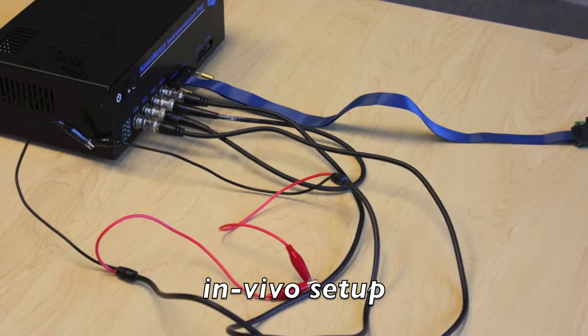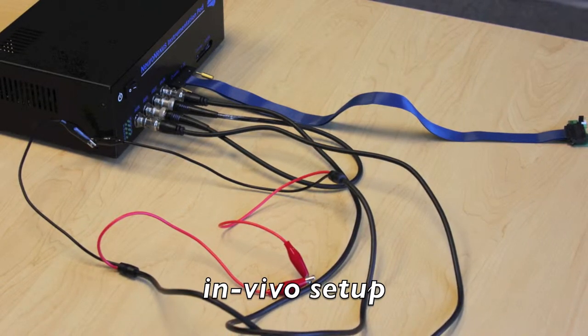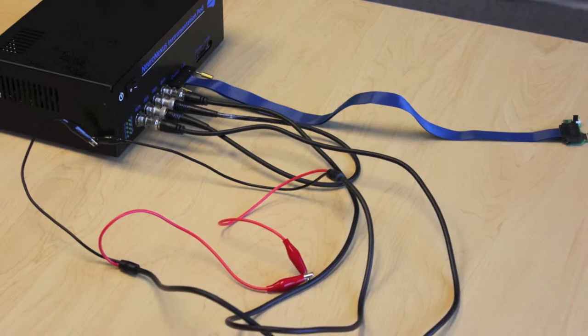Now we'll show you how to set up for an in vivo measurement. Because of the absence of a reference electrode, you'll have to make a few changes to the connections.